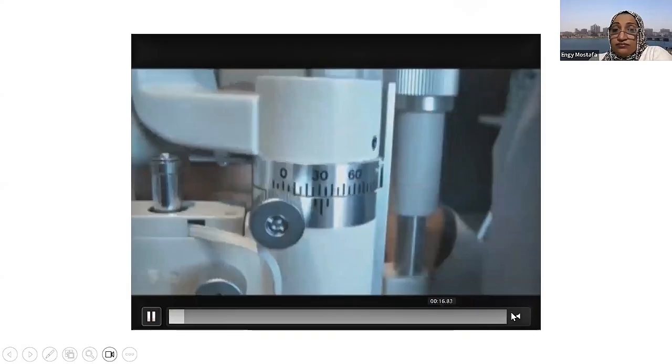So now we're going to indirect illumination. We've seen everything, so why are we going to do indirect illumination? Because sometimes there are some subtle things to see, and you need to see them more. The beam is focused on an area adjacent to the ocular tissue, and this area is observed in shadow. We are illuminating an area and looking at another place. What is the purpose? We are looking for a softer illumination to give better definition of structures like vesicles, erosions, vacuoles.